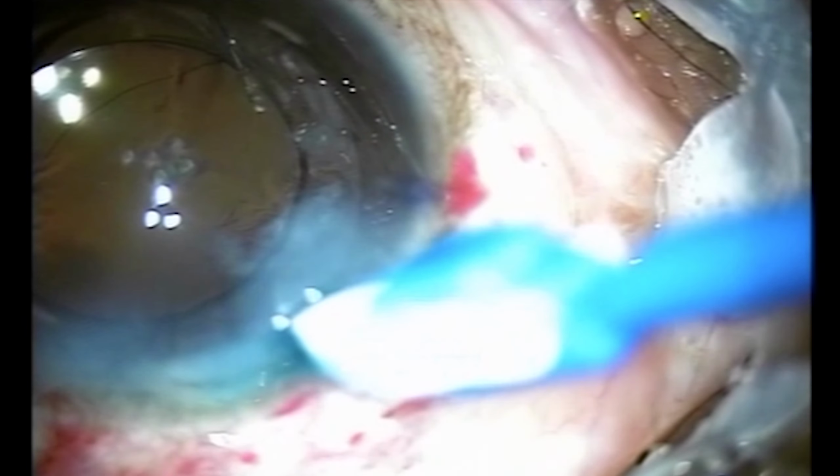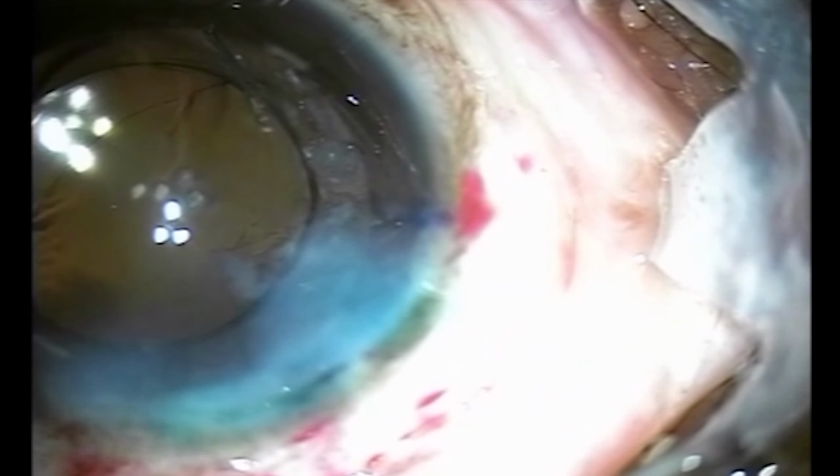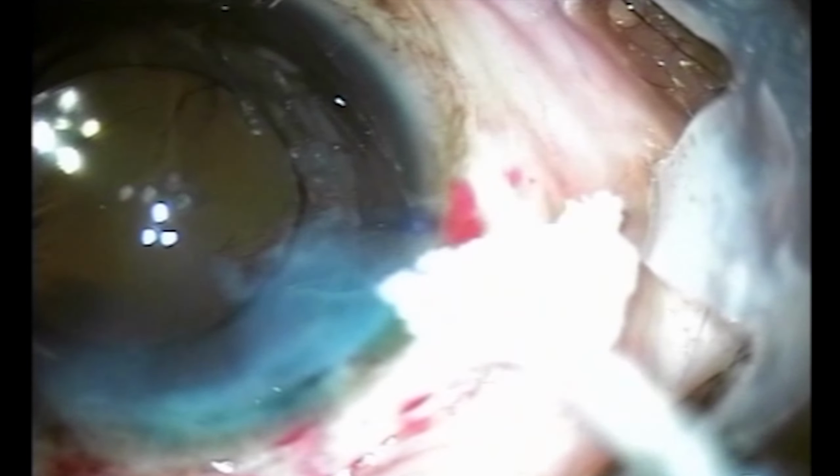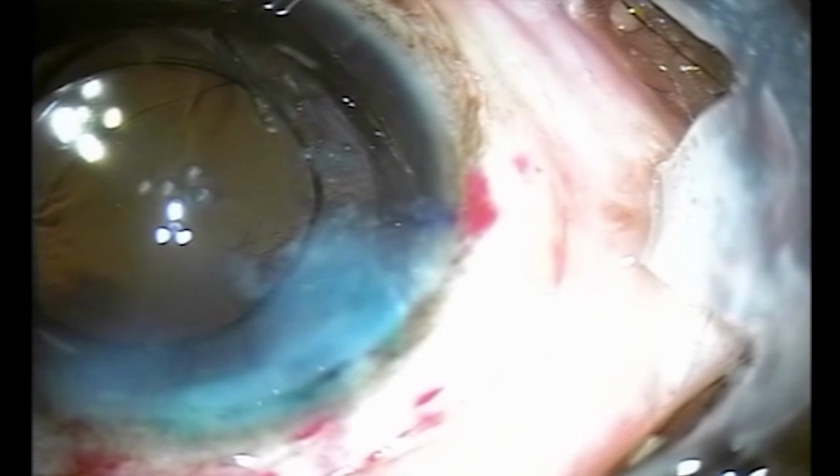The self-sealing incision is now further strengthened using the ReSure sealant. And here I am removing the excess sealant to prevent any irritation or foreign body sensation.